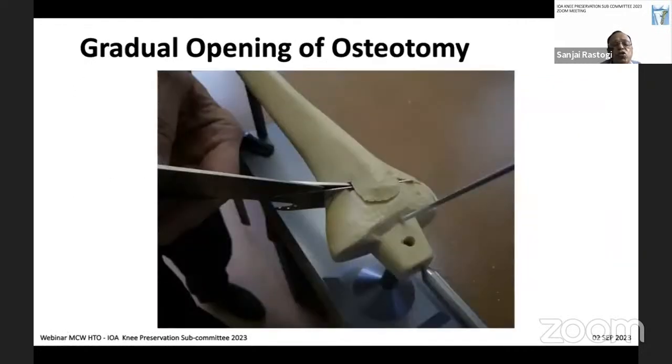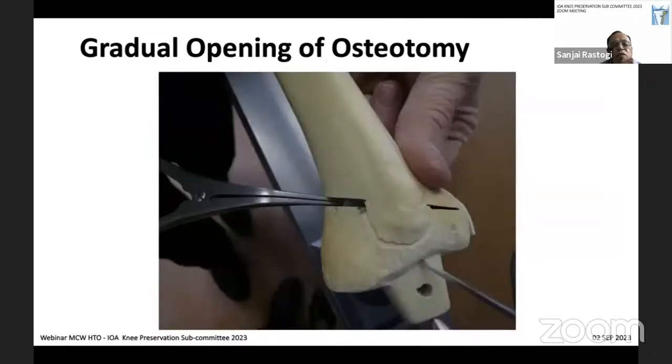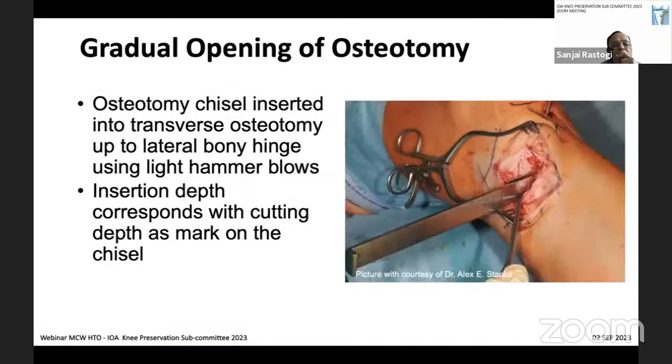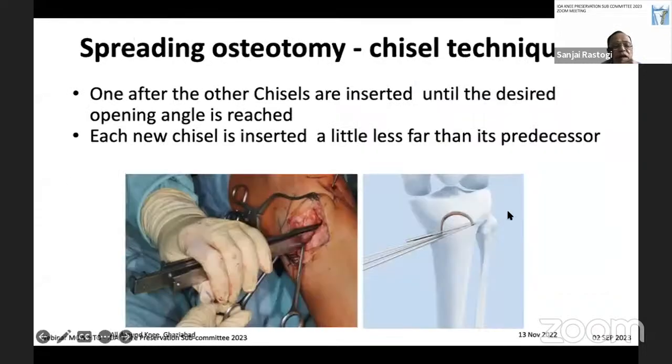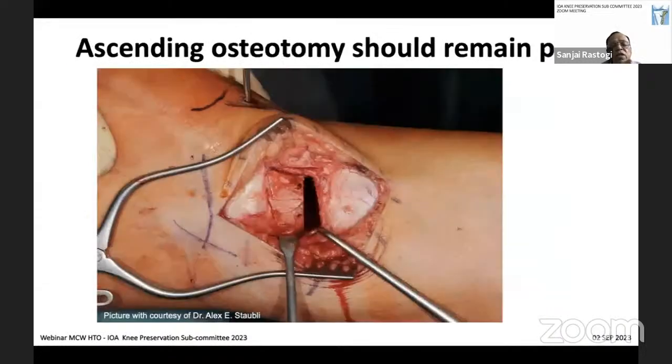And then we gradually open the osteotomy by passing one or more chisels. The second chisel is passed less than the predecessor. And we can open with a spreading bone chisel to the amount of correction which is needed. The second chisel is passed less than the previous one. And once the desired correction is achieved, we check by the cautery method or by alignment rod.